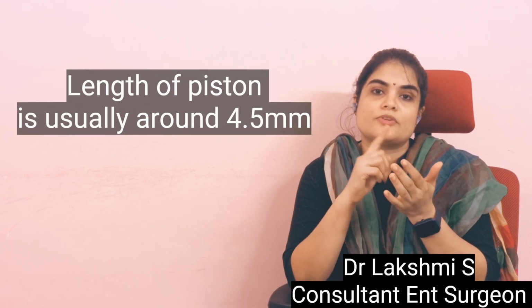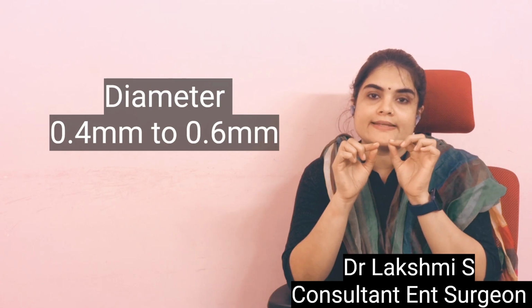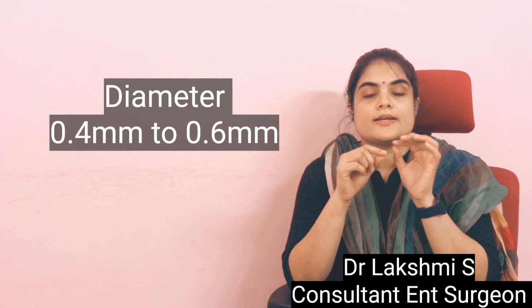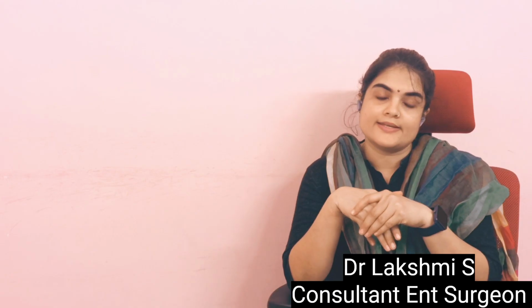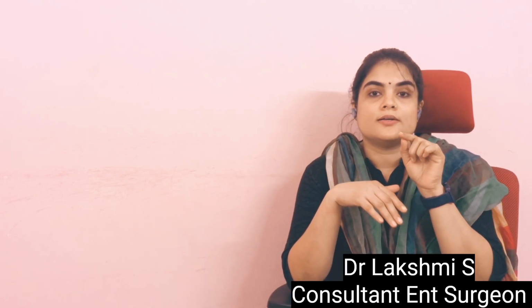And the width of the piston, usually we use 0.6 mm. So the fenestration has to be created slightly bigger than the piston. So that is a 0.7 mm fenestration you can create. And once the fenestration is created, you introduce the piston.